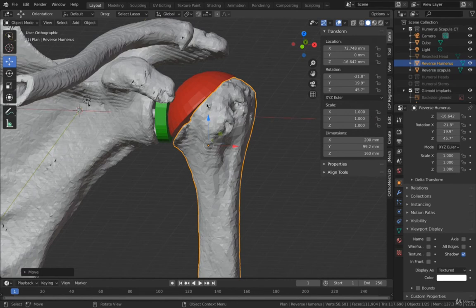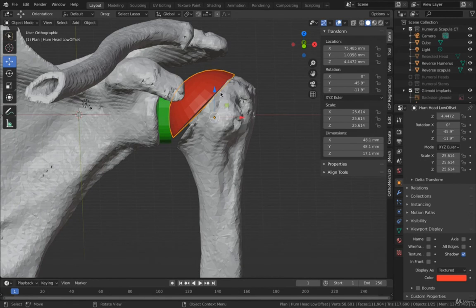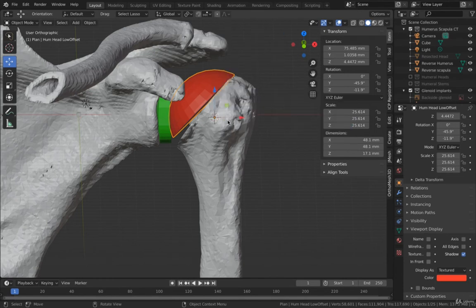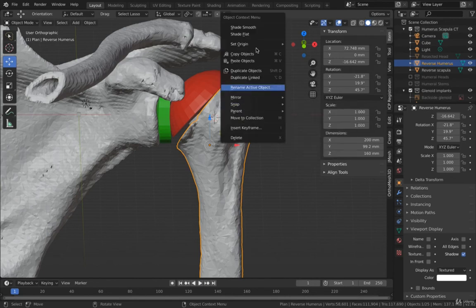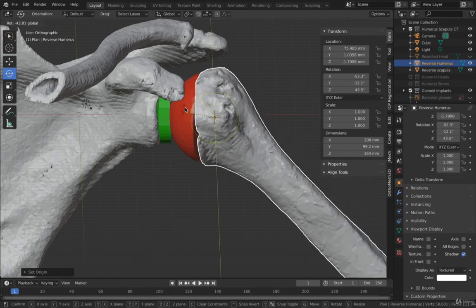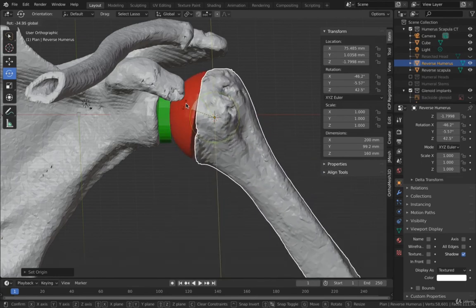Now if I want to find the center of rotation, it's pretty easy. So the way you would do this is you would select the sphere, that's the center of rotation, which is the prosthetic humeral head. You're going to right click and you're going to say snap cursor to selected. Now that brings the cursor to the center of rotation. And then I'm going to select my humerus. I'm going to right click again and I'm going to say set origin to 3D cursor. And then now if you select the move tool, you can see now that we have the rotation of the humerus on the glenoid component.